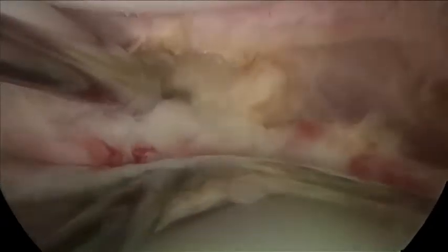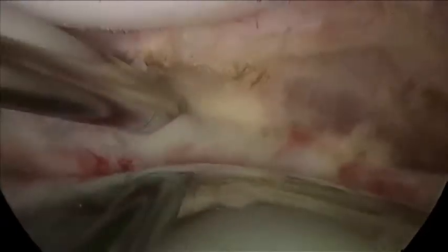The shaver is gradually swept medially and laterally to gain anterior access to the peripatellar tissue and the suprapatellar pouch. The suprapatellar pouch is cleared up to and including the deep quadriceps fascia. It should be noted that the reflection off of the femoral component can make proper orientation difficult initially, and care must be taken not to scratch the implant surfaces with the instrumentation.